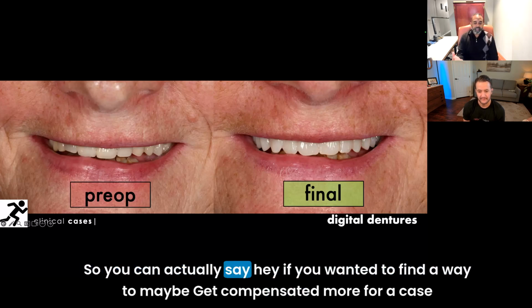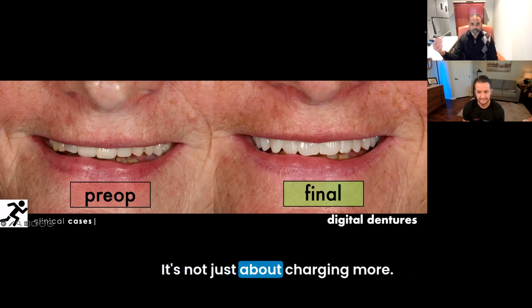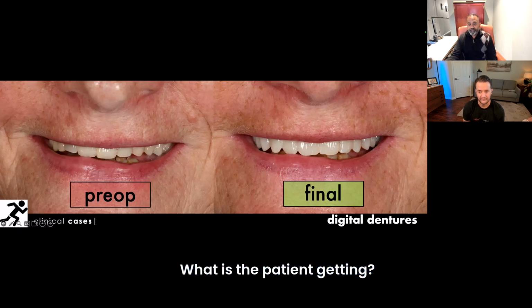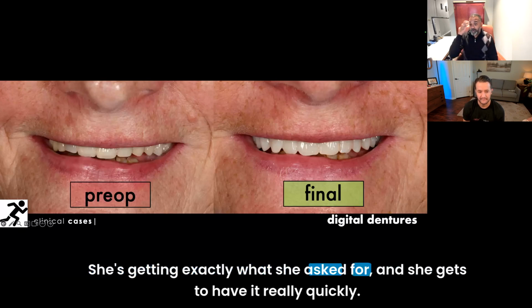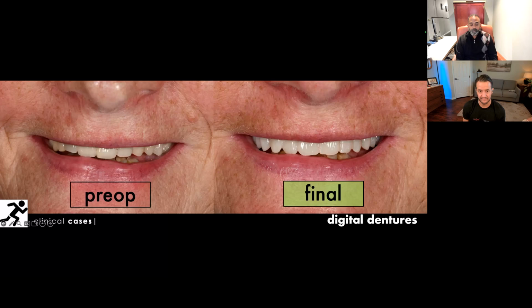So you can actually say, if you wanted to find a way to get compensated more for a case, well, you need to provide more value to your patient. It's not just about charging more. It's like, why are you charging more? What is the patient getting? In this case, the patient's getting a lot more. She's getting exactly what she asked for, and she gets to have it really quickly. The prototype denture becomes an emergency backup denture as well. We're literally building in value.